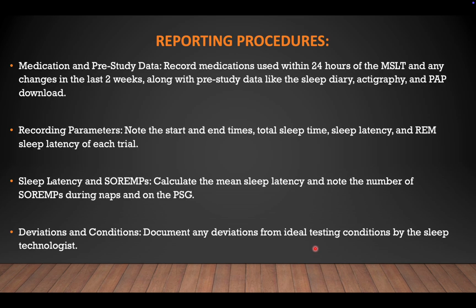Now, reporting procedures. The medication and pre-sleep study data need to be incorporated in the MSLT report, and recording parameters also need to be reported, like the start time and end time of each nap, total sleep times, sleep latency, and REM latency of each trial. Sleep latency and SOREMs, these are the two things we are looking at from an MSLT, and hence they have to be clearly mentioned.